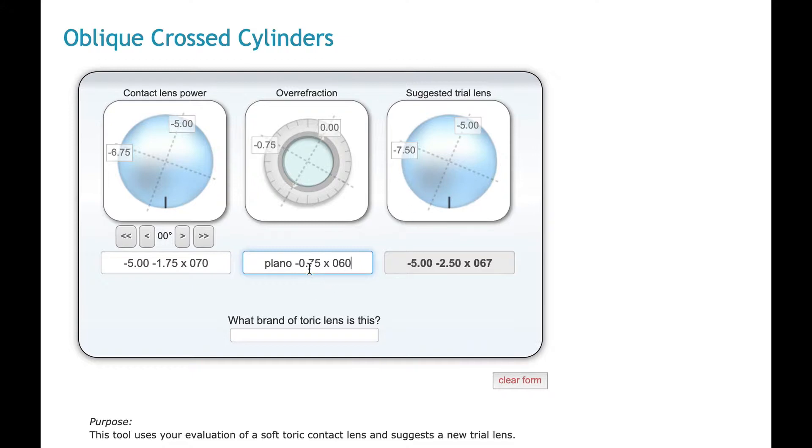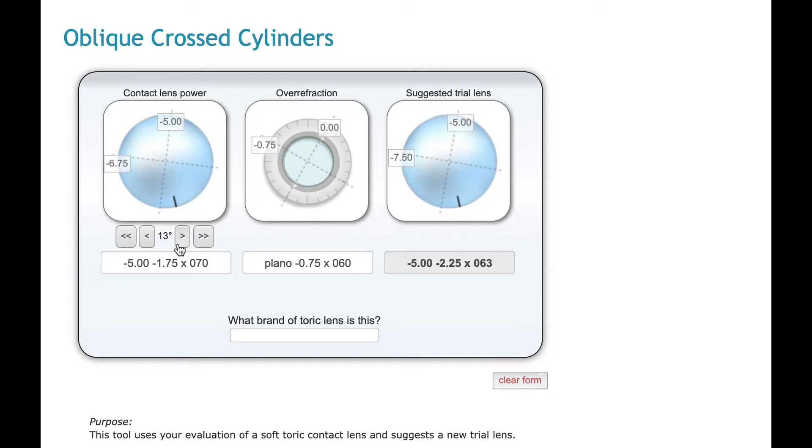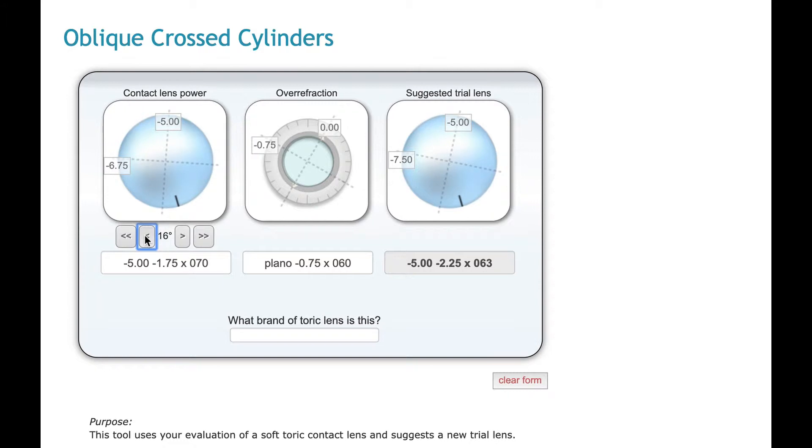We can see that in this case, we need more power in the meridian that is 90 degrees away from the axis, which is 60. You can kind of look at those meridians and it just makes sense. You can also denote the lens rotation simply by clicking the lens. Or if you want to fine tune it, you can use these arrows here too. So why don't we just say 15 degrees. And here's our result.